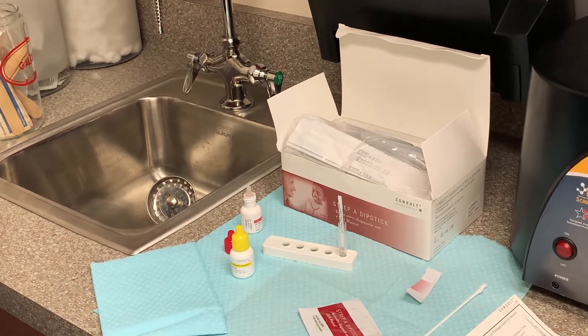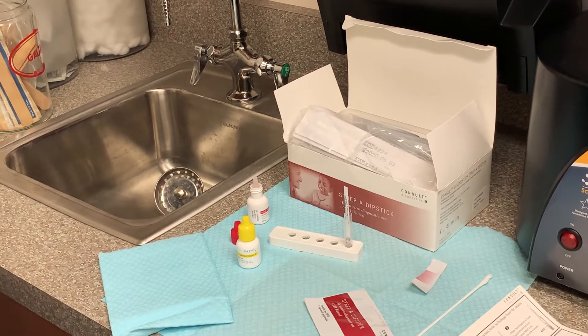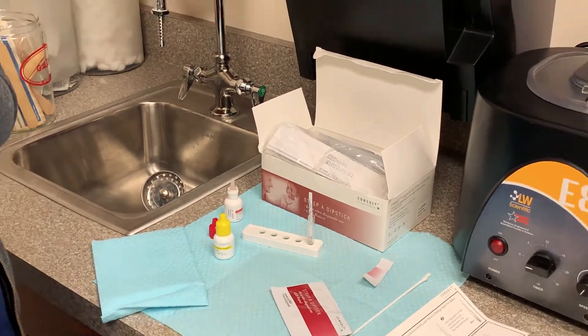And we're all set. We'll wait for the results. We'll see if my test has strep. I guess it'll be your five minutes.